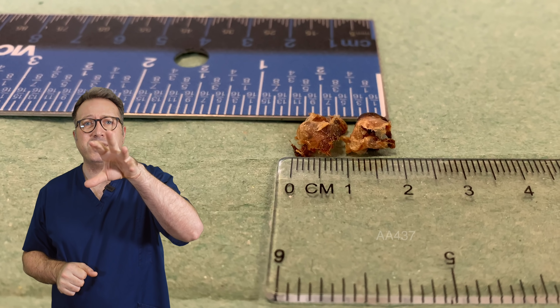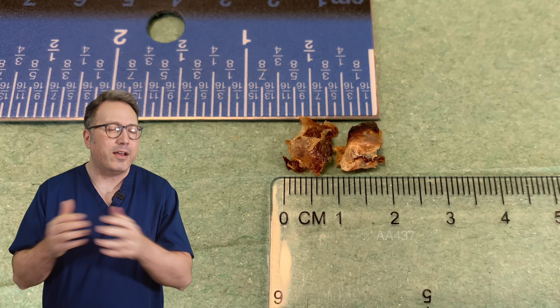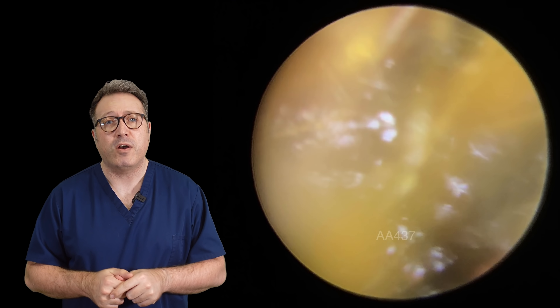So this is what we removed — you can see these big chunky old plugs. Two centimeters, that's three quarters of an inch. You can see that's come away really, really nicely and you can get a good look at that dry skin on there as well.